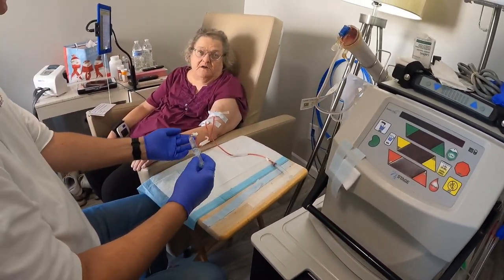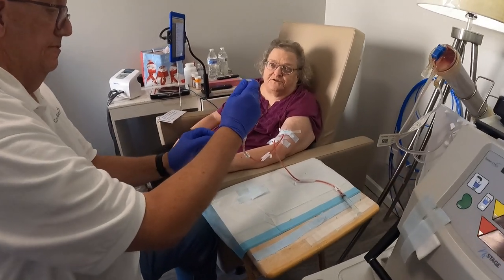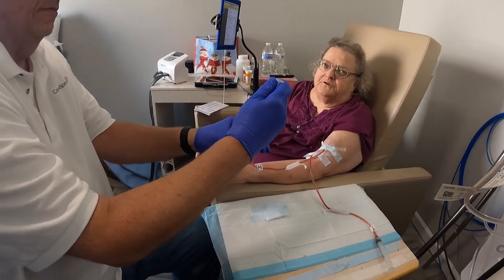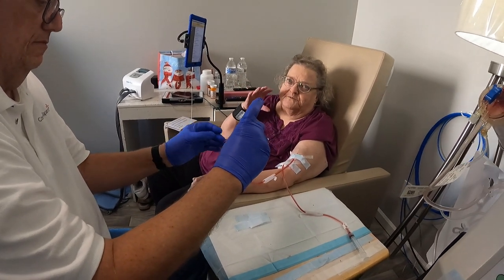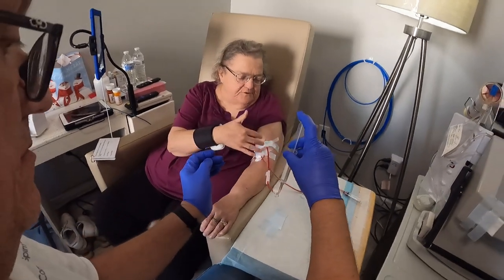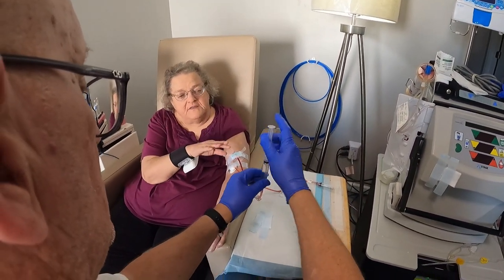And then you want to watch, a lot of times we forget to do this, because you don't have to. It's not something that they train us to do. We typically will do it just because of my blood pressure. We want to get as much of this blood and fluid back in me. And we account for all of this.